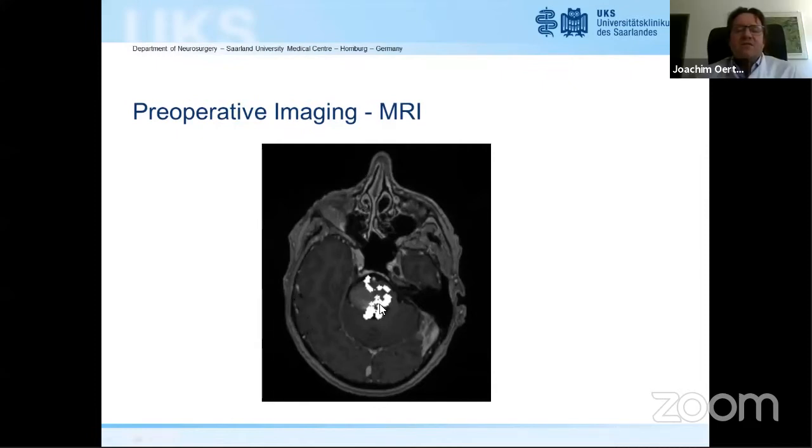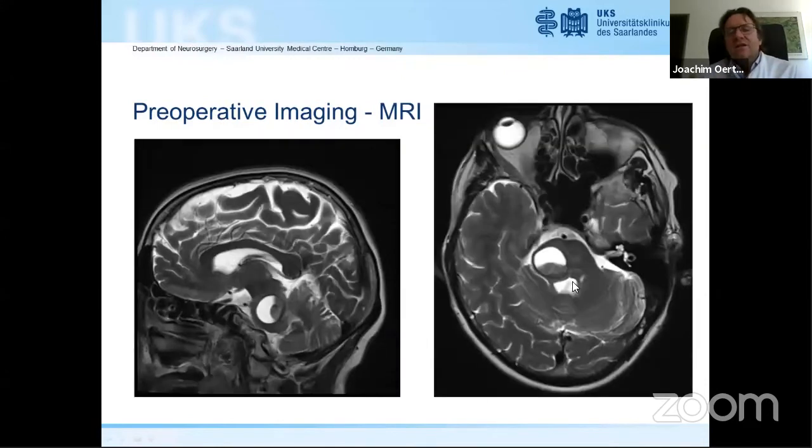So what are the options? If you have a brainstem lesion, we go back. Usually it's very safe, you have a suboccipital midline approach here, but this would probably mean that you do not have direct access. You can come endonasal, right next to the basilar artery, but there's a lot of tissue here.